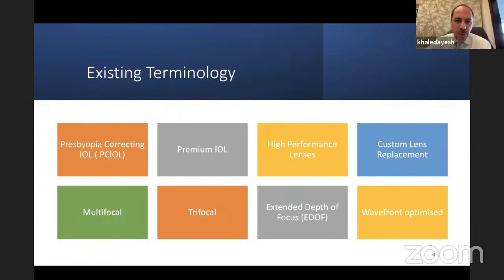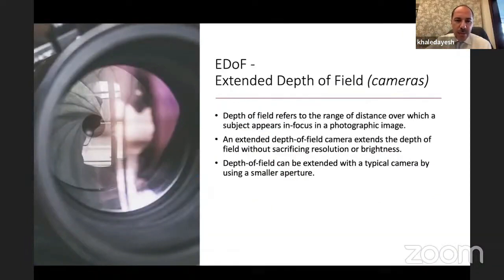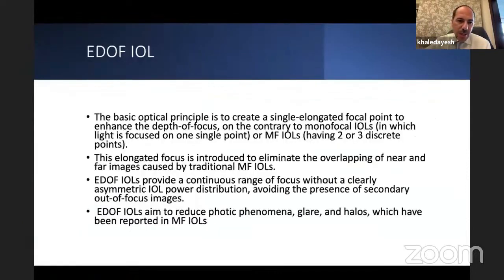Okay. So there are many existing terminologies, and we said extended depth of focus, as we mentioned, extended depth of field. It comes from the camera, and that's why I said that the only true EDOF lenses are the ones with the pinhole effect, because this comes from the camera, where these cameras use pinhole lenses.